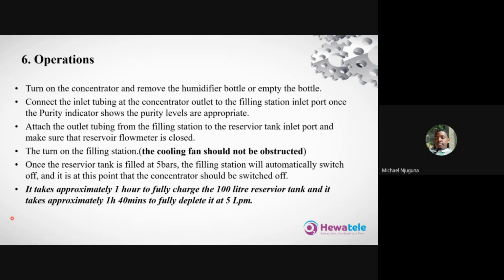So first of all, as you're using a concentrator, you need to be cognizant of the operations of a concentrator, which again, I would urge anyone who wants to know more about concentrators to visit the Oxygen Alliance platform for more information. So turn on the concentrator and remove the humidifier bottle or empty the bottle. Of course, you don't want moist oxygen to get into the system.